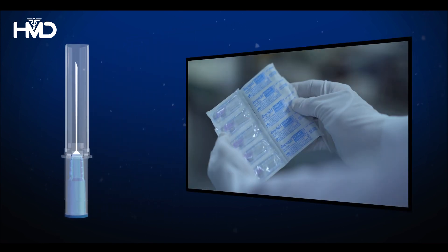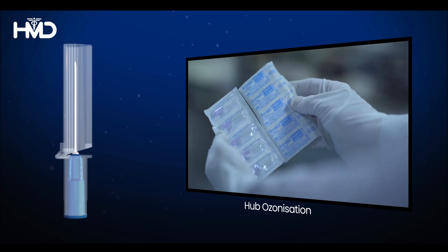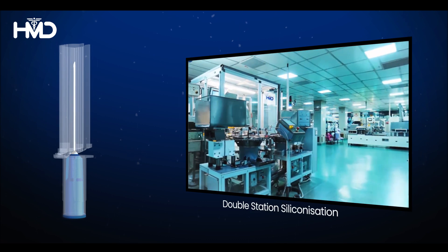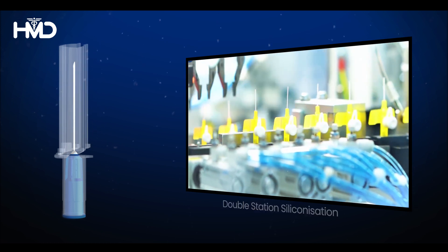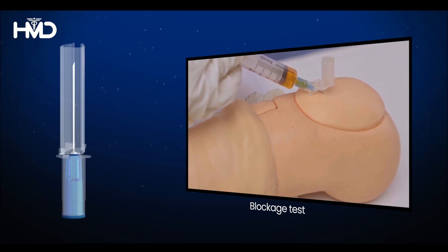The machine used to manufacture Dispojekt safety syringes is equipped with hub ozonisation to enhance needle bond strength, double station siliconization to ensure minimal pain during needle penetration, and a blockage test to guarantee the unrestricted flow of medicament.